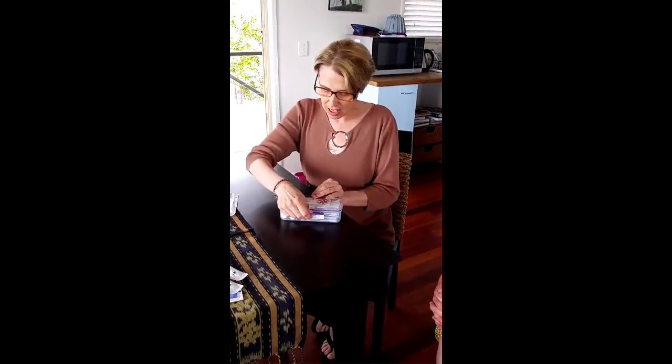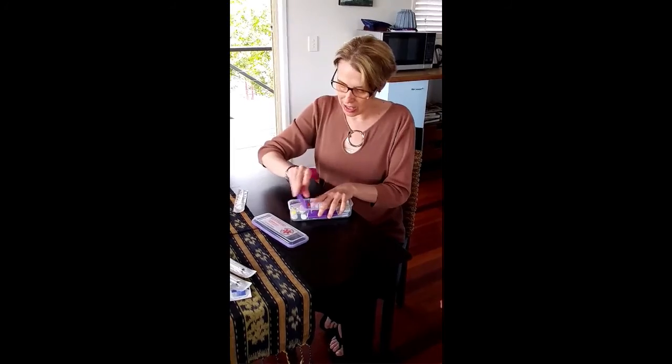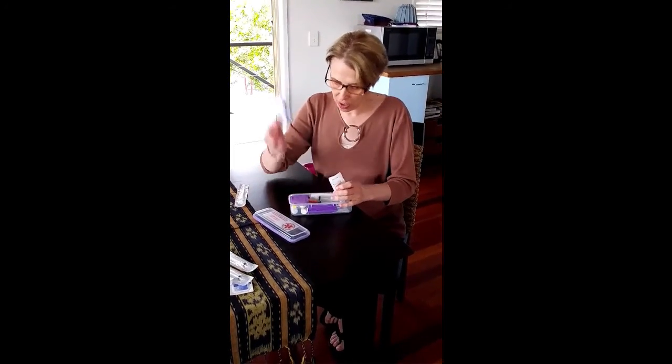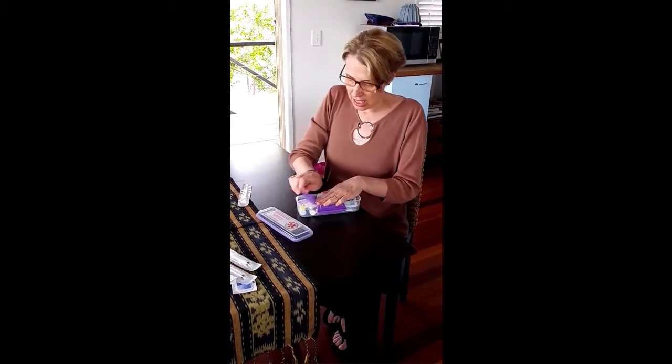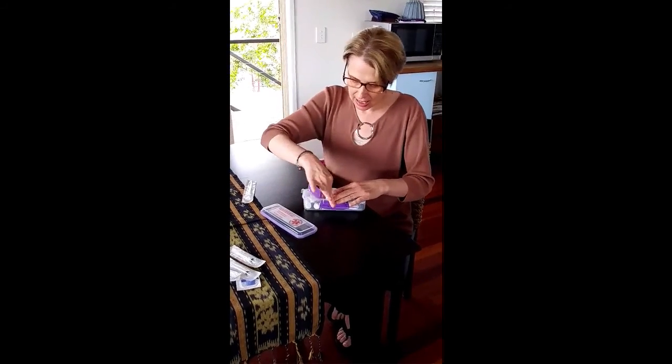I have my injection kit, and because I live in Hong Kong I have it in English and Chinese. Inside I've made this from a Tupperware container, and I have my needles, my solu-cortef, a letter, and an instructional leaflet. So I would need my solu-cortef and water — the two elements.